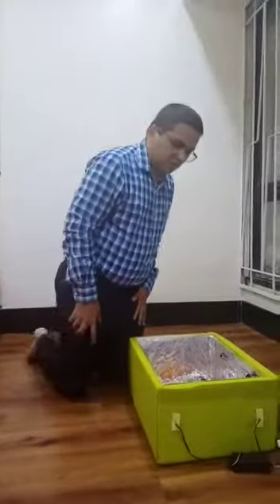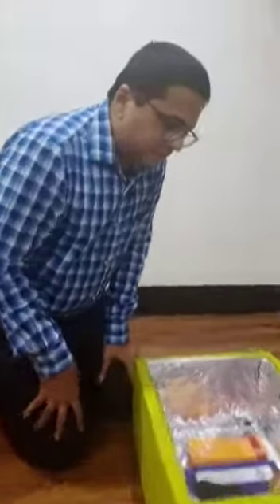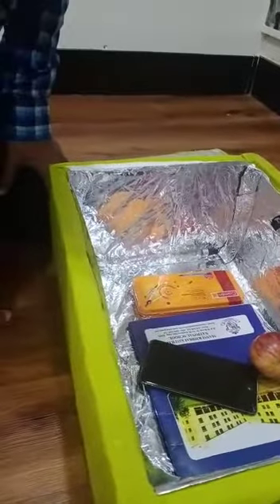Hi, I am Dr. Deerah Surana. I have made a UV box. It contains three bulbs of UV-C rays of 11 watts. One is at the upper level, one is at the lower level, and one is at an intermediate level. And it is surrounded by silver foil.